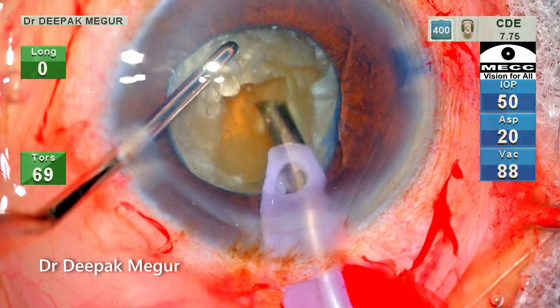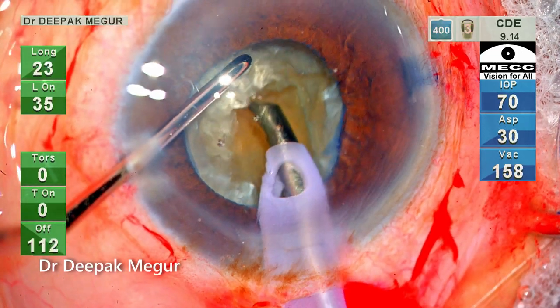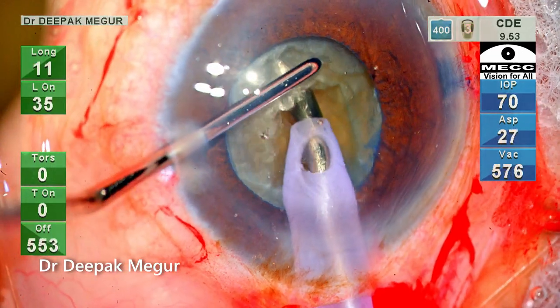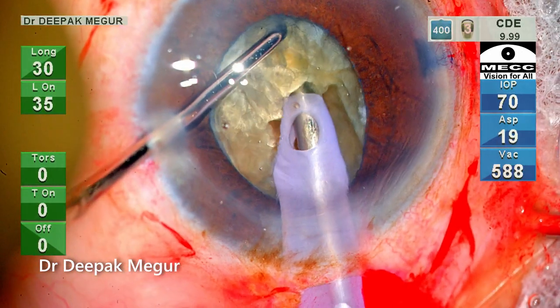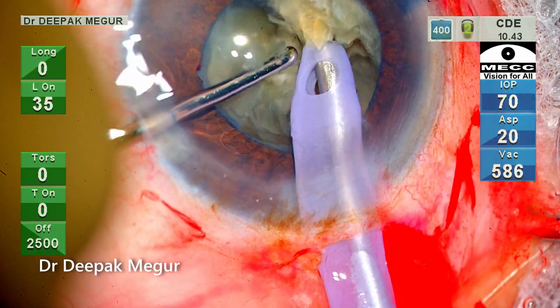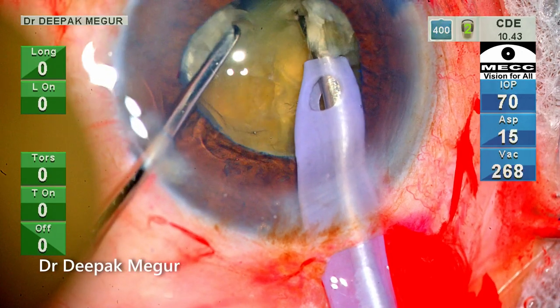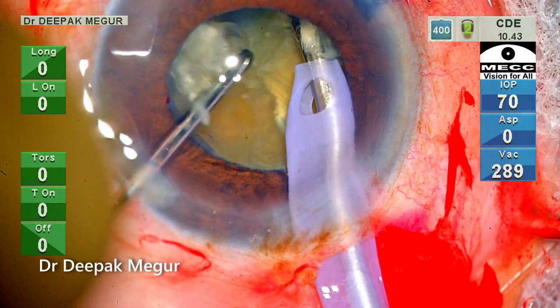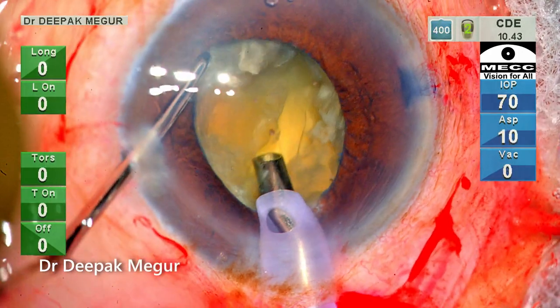A few sculpts are done to create a central trench so that I can bury into the central core of the nucleus. Once I bury my tip deep inside until the entire tip is buried and it touches the sleeve, the vertical chop is done. Well, you can note that the microscope centration is not great at this moment. I am probably focused on just the maneuvers inside.